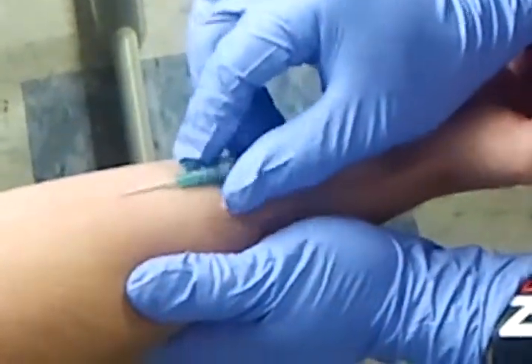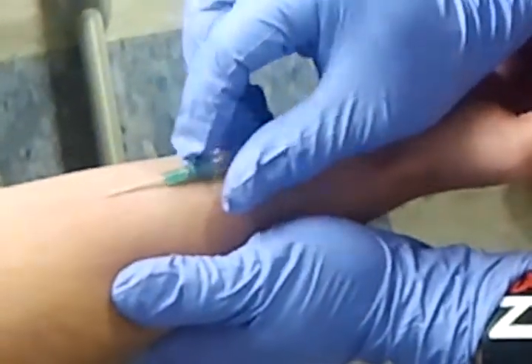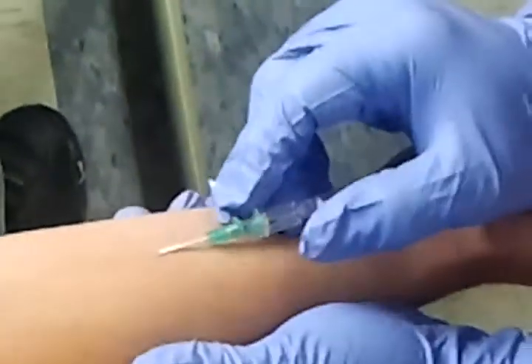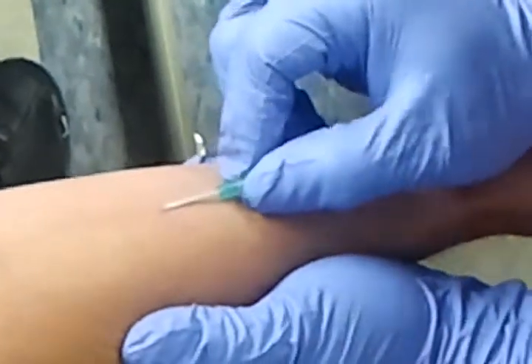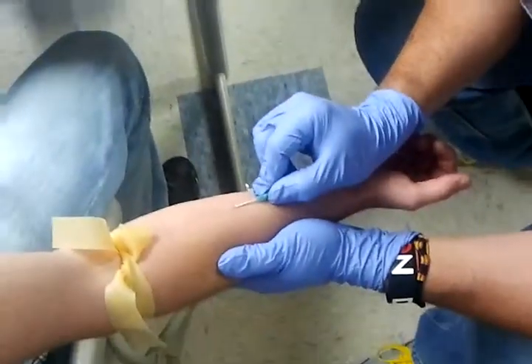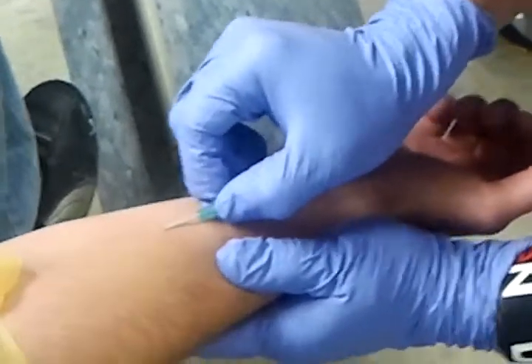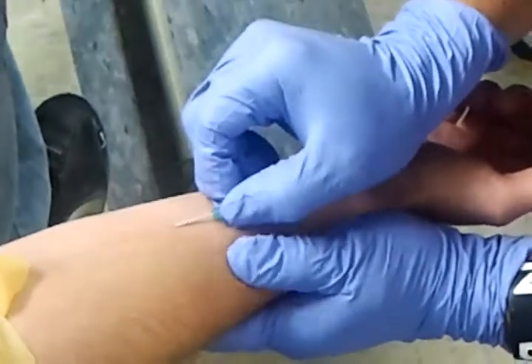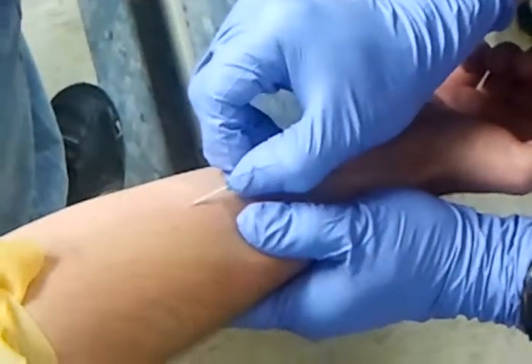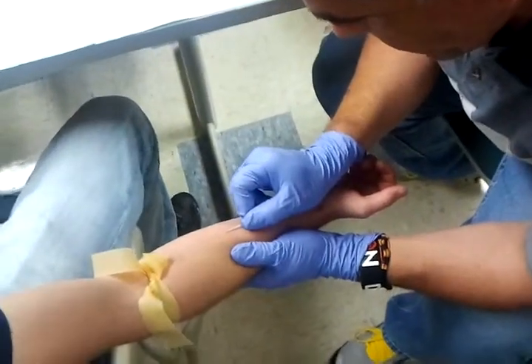I'm just backing out a little bit to see what I can find out. A lot of you guys are just barely going in, so you don't have any room to back out — and see, his vein just disappeared. You may see Troy miss this one. I'm going to label this one 'Troy fishing.'